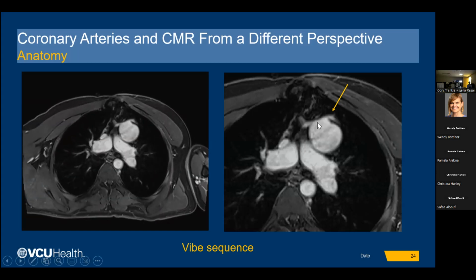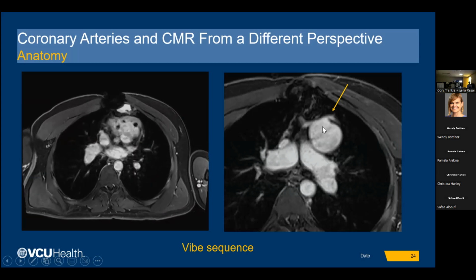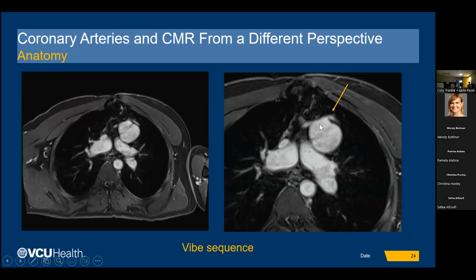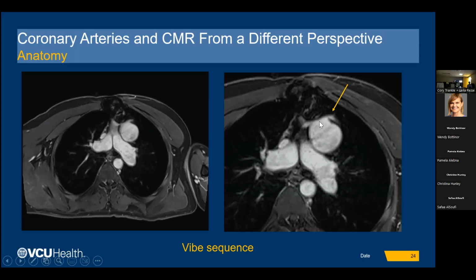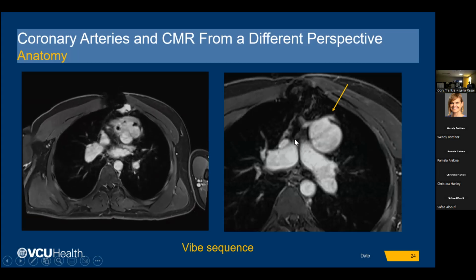So we have what appears to be a bicuspid aortic valve, and the anterior valve gives rise to two coronary arteries with separate orifices, one of which goes to the right and one of them is going to the left. And they appear patent and of appropriate lumen size.